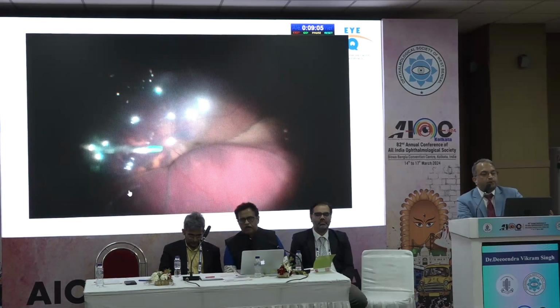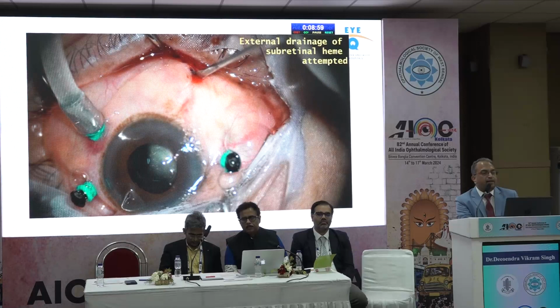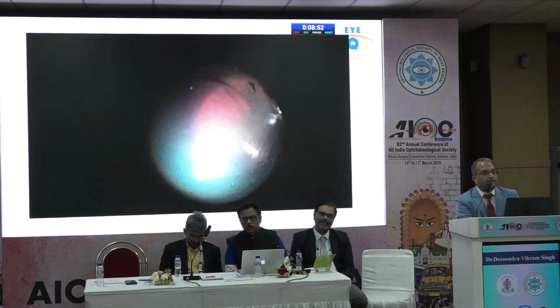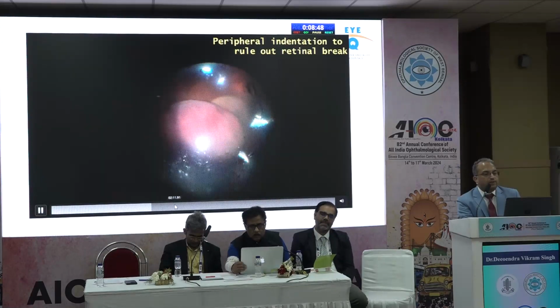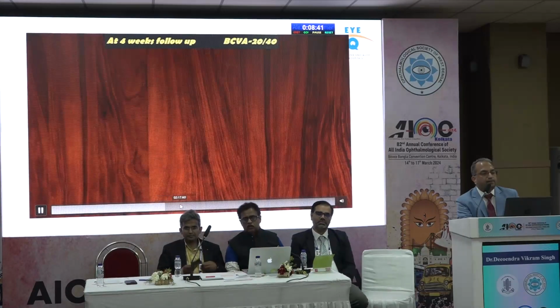But when I was doing fluid air exchange, this whole thing ballooned like anything, and it was threatening to involve the macula. So I tried draining it transclerally, just like we drain suprachoroidal hemorrhage, I thought I'd drain the subretinal bleed. It didn't drain. So I decided to leave it alone, just with gas, and she recovered very well, 6/12 vision.